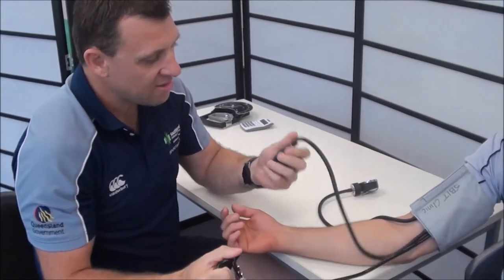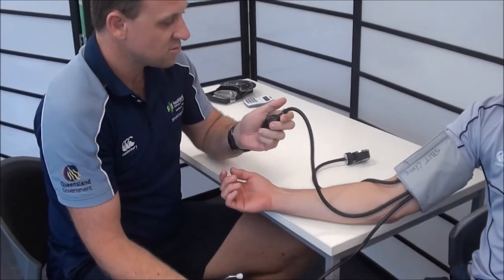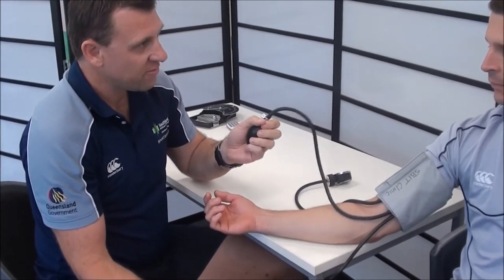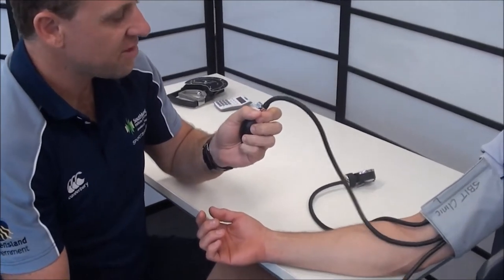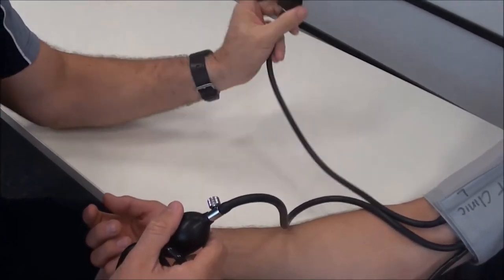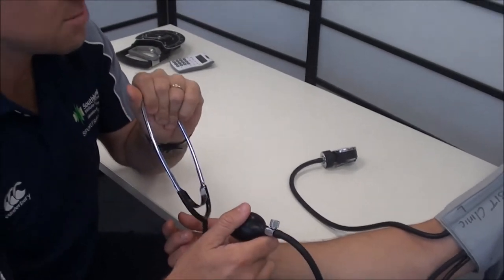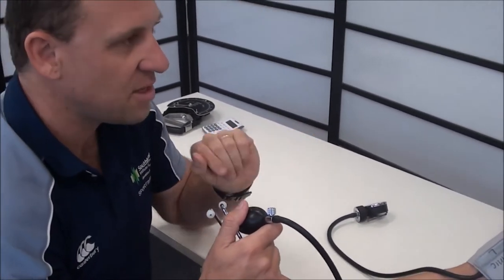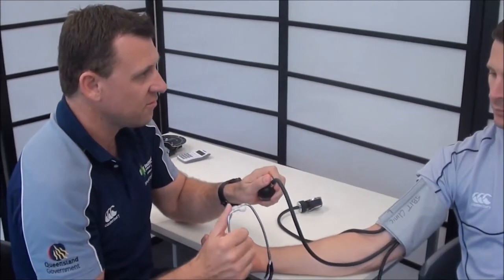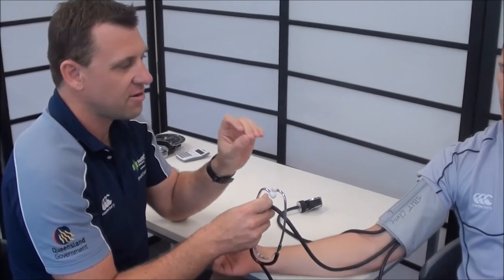The key thing here is to make sure the cords don't touch if we can avoid it, because that can give you a false reading — you'll hear a tapping sound. I'm going to inflate the cuff up to 170 on the readout and listen for tapping sounds. At 170 we shouldn't hear anything, then I'll slowly release the pressure and listen for sounds — that's the blood starting to move back through the artery.